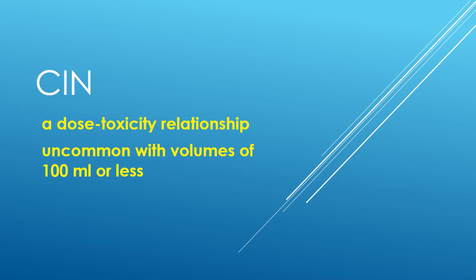So if you are going to give IV contrast less than 100 ml, you need not fear contrast-induced nephropathy. Now, obviously, we are talking about low osmolar contrast media and the isoosmolar contrast media. And this is why you should always wait a day between two contrast CT studies.